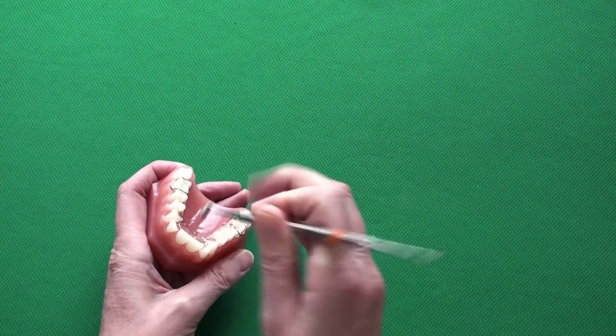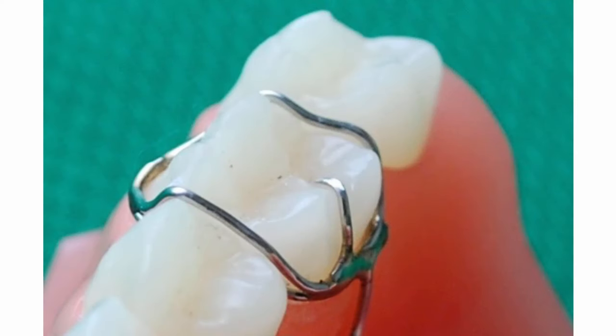Observe how the occlusal rest lines up with the tooth surface. If there is no gap in between, the crib is fully seated.